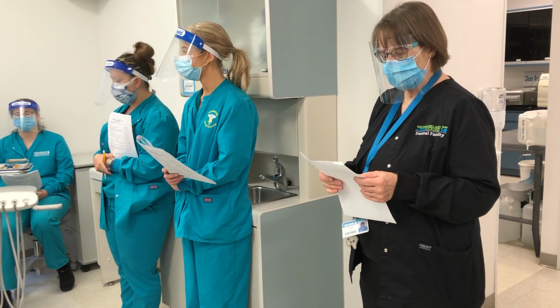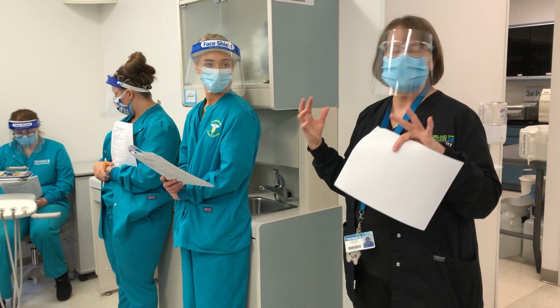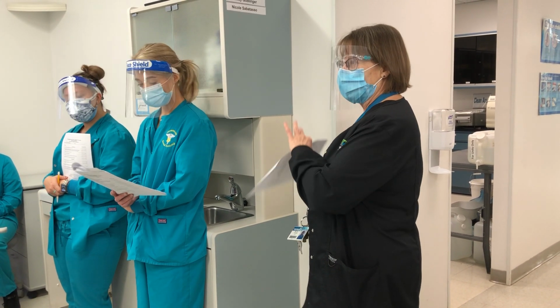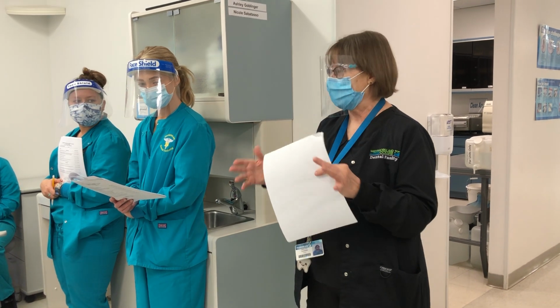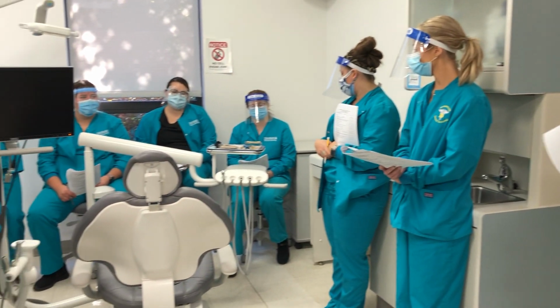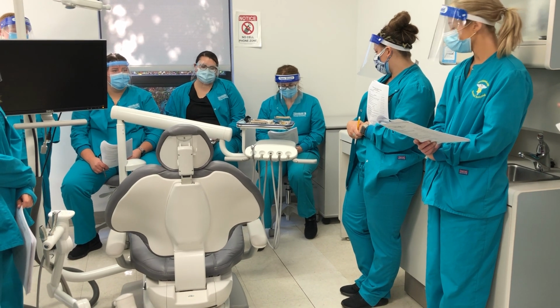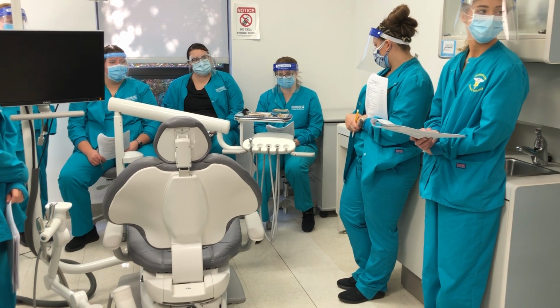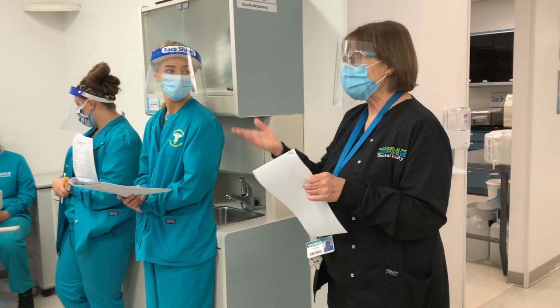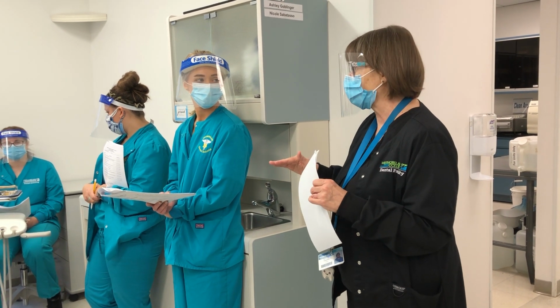The next thing it says is that what you're envisioning is that the patient you've just walked out to the reception room is taking care of paying their bill, and now you come back and this is what you see. You have a contaminated tray there, and it's getting you through the steps. When you're at pit, everything will go into a bag, and then it magically goes to the sterilization room, and they take care of it. In private practice, there's no magic. You are the one, and that's why you're practicing this. It's one thing we cannot do a lot of practice at pit. You get lots in the summertime.